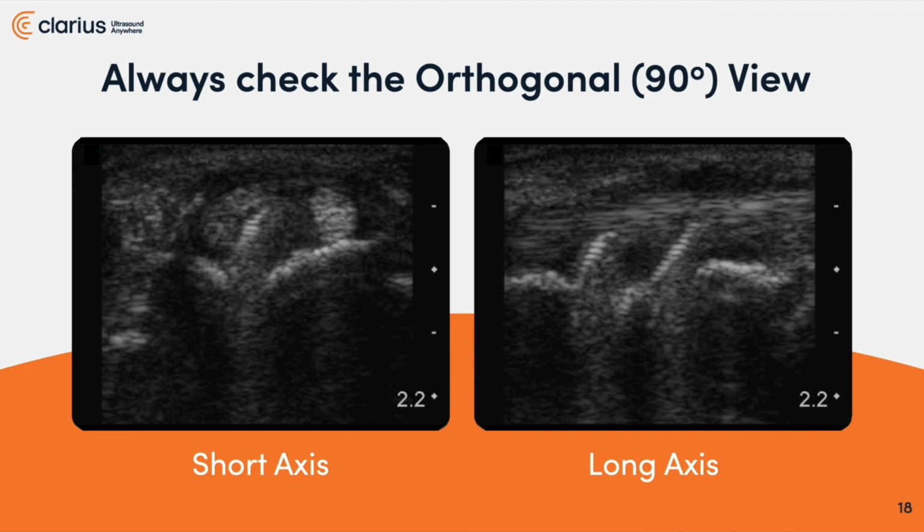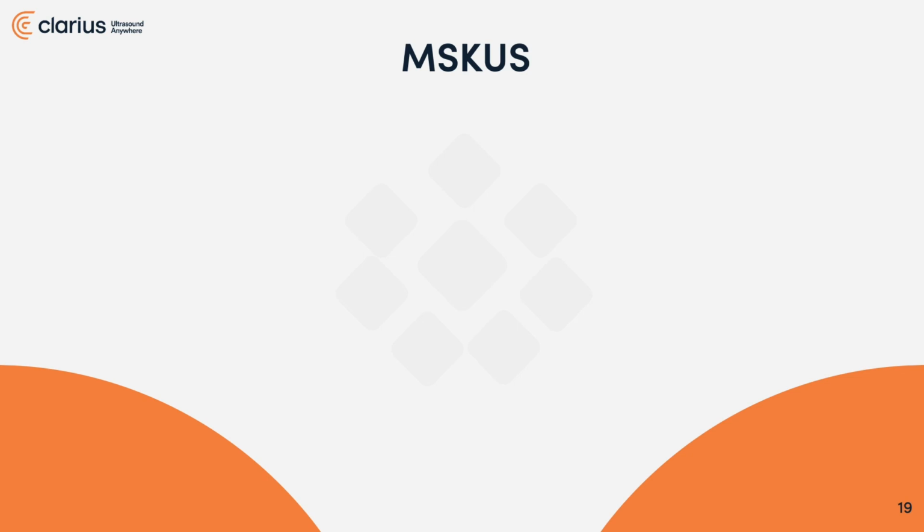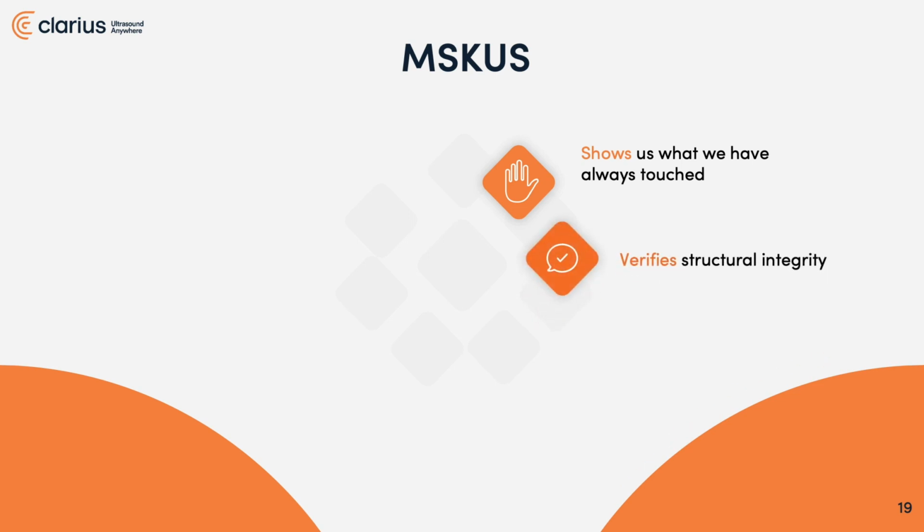So in summary, I'd like to go through a couple things as it relates to how I would put together what is musculoskeletal ultrasound imaging. It is a tool that literally shows us what we have always only palpated. Musculoskeletal ultrasound imaging verifies structure integrity: a ligament, a bone, a tendon, a muscle. It allows me to quantify inflammation based on the amount of darkness, which is fluid, within a tendon. I'm able to watch that tendon become lighter and lighter until it actually compares directly to a healthy tendon.